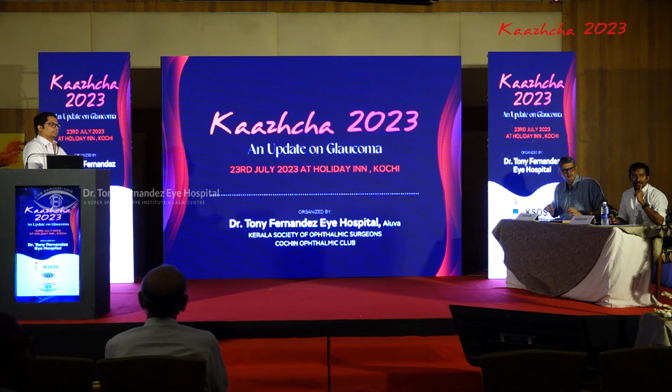Hello. Honestly, I rarely use the UBM. Out of 100 up to 200 patients, I need UBM for one patient because a good gonioscopy usually gives you an idea of what is going on behind also. And with the ASOCT coming in, we don't need the UBM for what is in front of the iris. So it's when I suspect that there is an iris cyst or something sitting behind. Quite often I do the UBM to find the haptic of a lens, whether it's in the sulcus or not. With the ASOCT coming in, I use that for what is in front of the iris. UBM is actually a very rare situation.